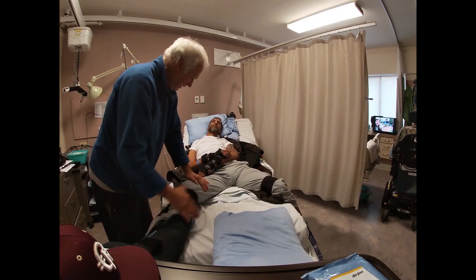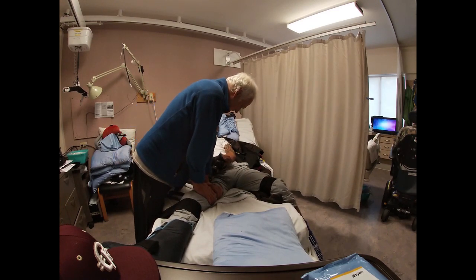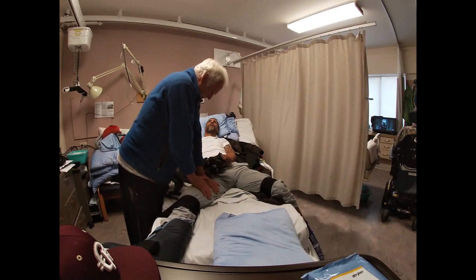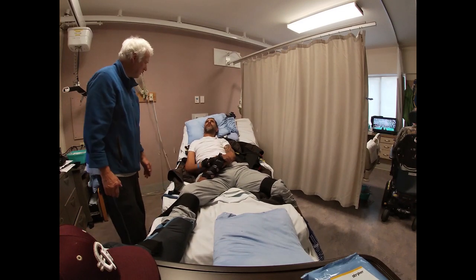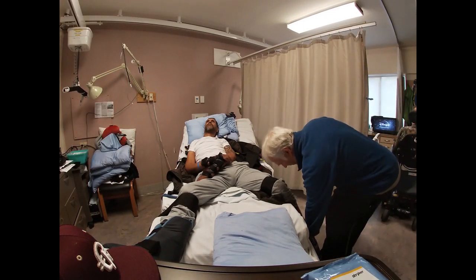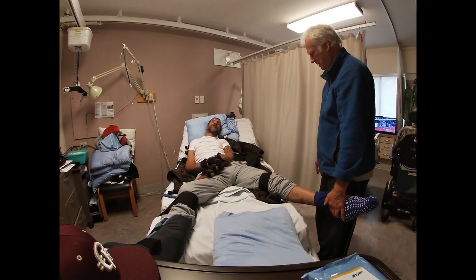Okay. And how's that spasm here? As soon as I put the pressure here, it's not as bad. Like I can feel the spasms coming on. My whole body gets really tight. But see, it was at a 60% before. It's at like a 35. All right. And so if I move this leg here, is the spasm coming back at the shoulder or arm? It'll do it, but it's not what set me off earlier.